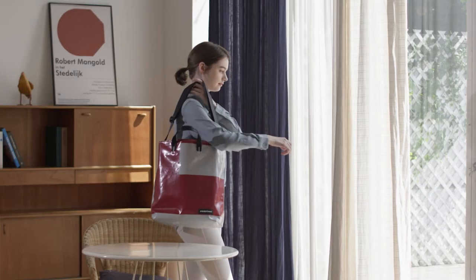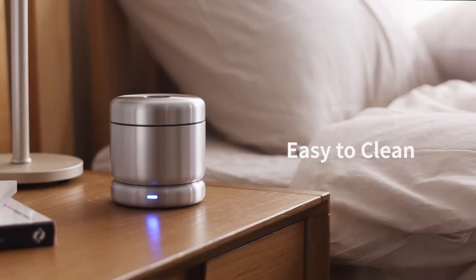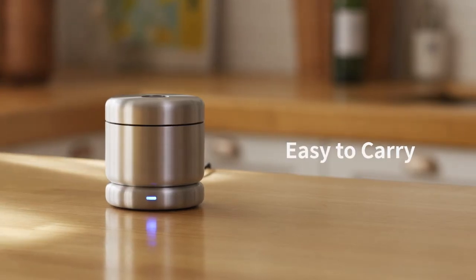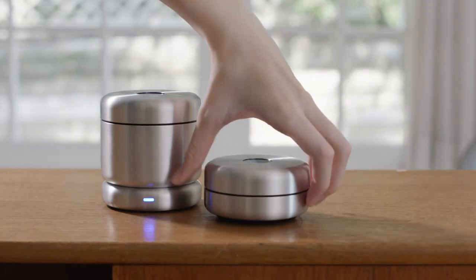The Cleam is portable, making it convenient for travel. Easy to clean. Easy to carry. Perfectly sanitized. Cleam.